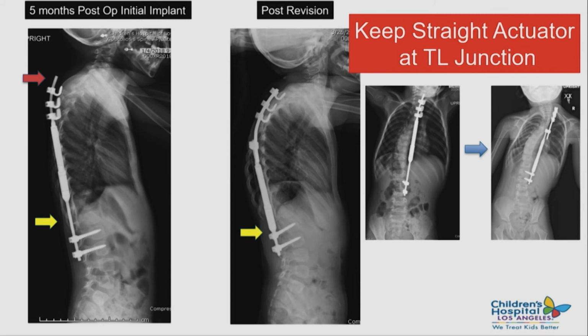Okay, so first question, when you're going back to put in hooks and hooks are pulled out, there may be fused ribs. One thing is, because there's so much bone, 1 hook may be enough, or you could just go in with a burr, cut a hole right in the middle of the rib mass, and put in another hook. So it's pretty easy, I think, to get hooks into bone. If there's a lot of bone, we could put hooks in them.